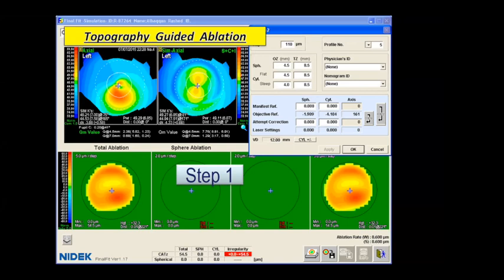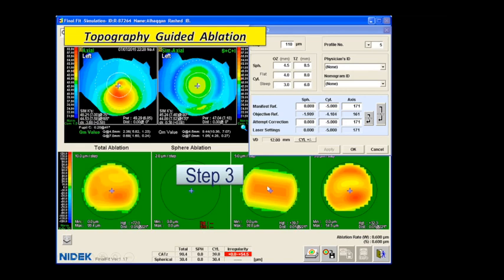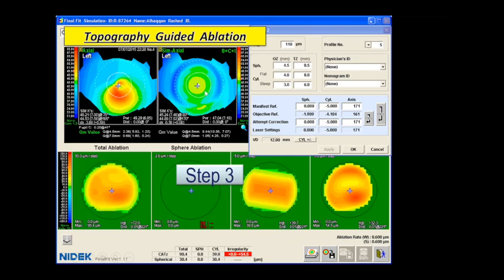Again, the steps: from irregular, change it to regular by topography guide, and then try to correct the astigmatism to get a good result. But really, this astigmatism, if we look here, the cylinder will take 84 microns, which is too much. I cannot accept that. So I have to reduce the treatment zone to get better. Look here, I reduced it to become 39 microns. Before it was 48, now it becomes 39, and it is a small zone and very well corrected. Astigmatism 3.68 becoming 0.36.